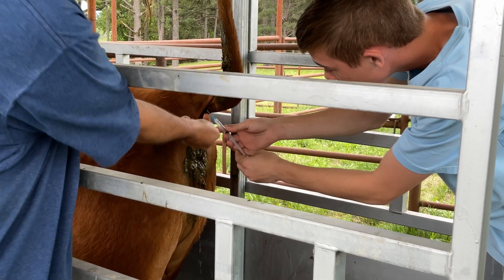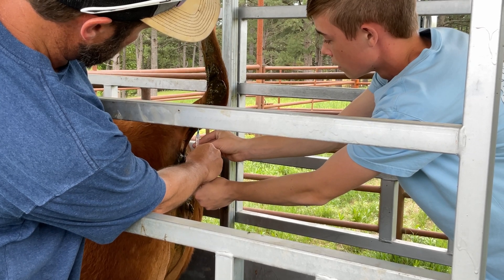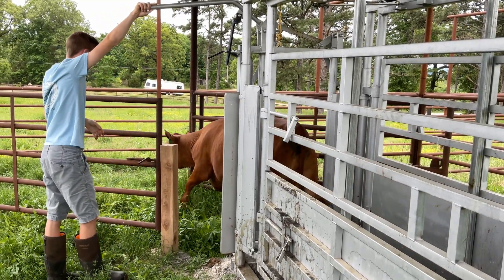I actually got to draw blood from the cow this time. It's very tedious work, but I think I did a good job if I don't say so myself. We then mixed the blood in with a solution, and then waited patiently for results.